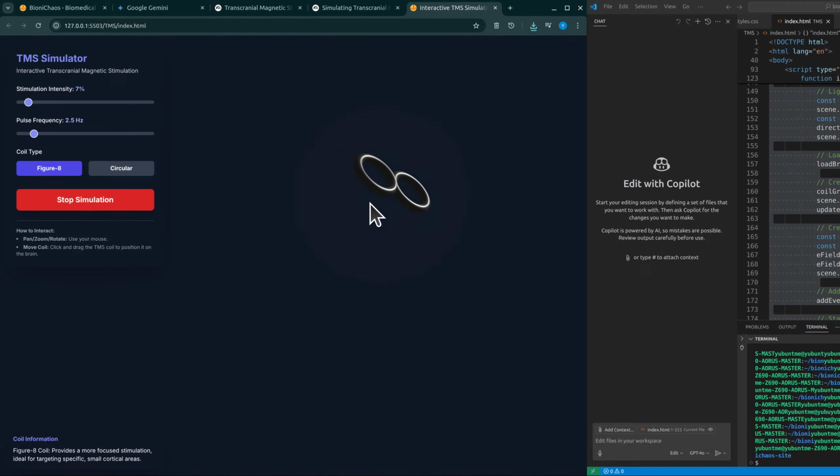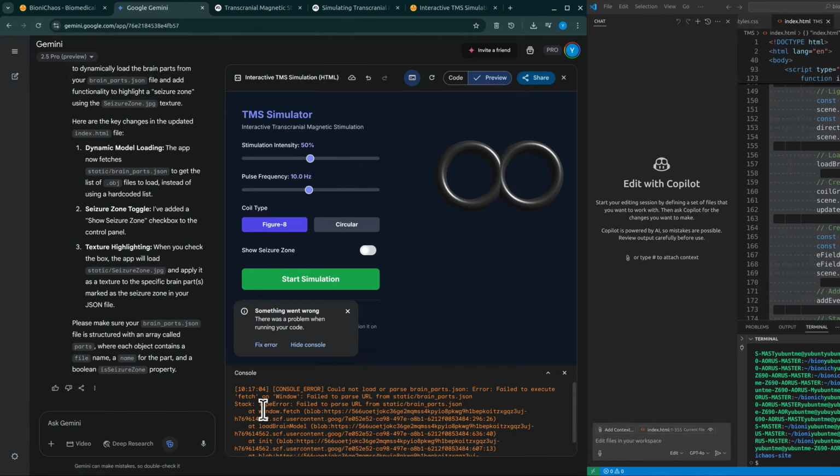Right, it's about seeing that magnetic field interaction clearly, understanding the underlying mechanisms, figuring out better treatment protocols, and ultimately moving towards truly personalized therapies. That's the goal here. Exactly. And the way it's approached, according to the material, it's like building something complex piece by piece. A multi-stage process, starting with creating a digital twin of the person's head. Well, it's absolutely foundational for everything else.